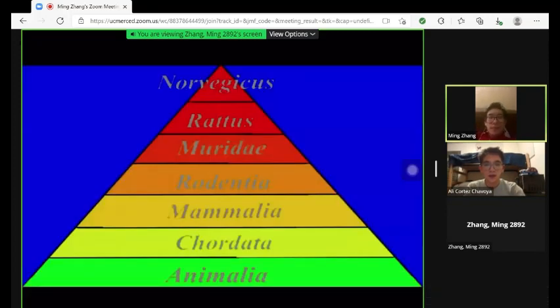So the animal that we picked to dissect was a rat. Rats belong to the Muridae family, being the largest rodent and largest of all mammalian families. For rats, we looked at its ecology and habitat, the way that they live and interact with each other, and their environment.